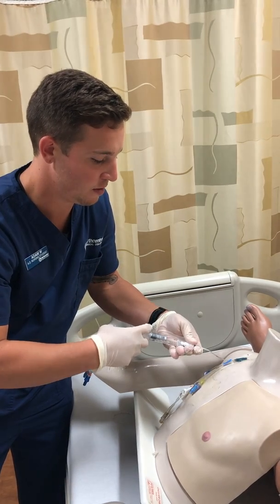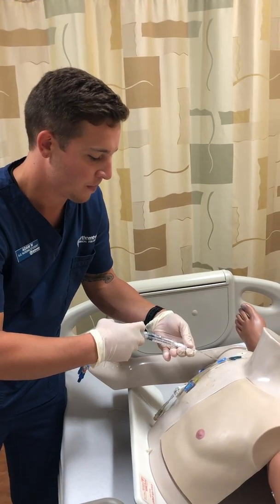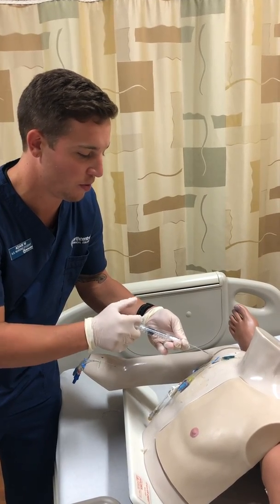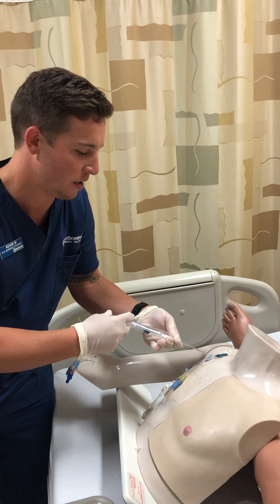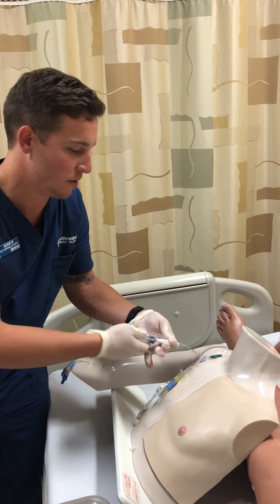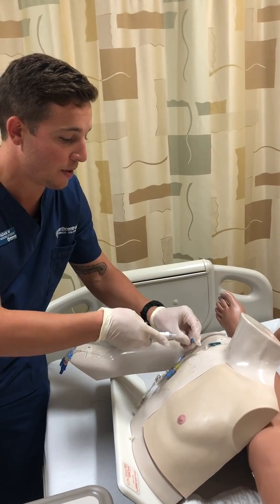Same thing, nice and slow. If this wasn't a PICC, we would be pulsating these last ones. It looks like this, but we wouldn't be doing this for our central line here. Okay, so when we're done here, we're going to reclamp.